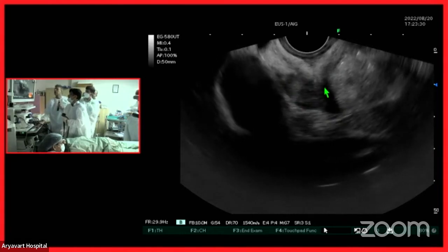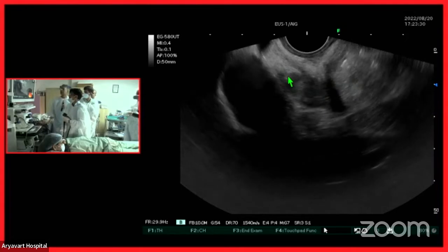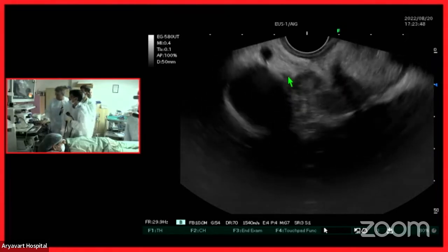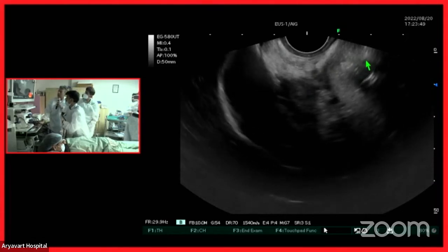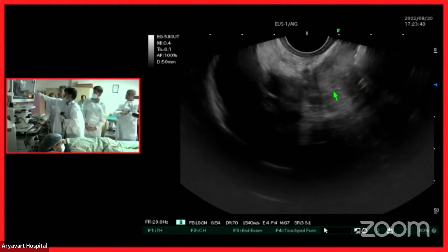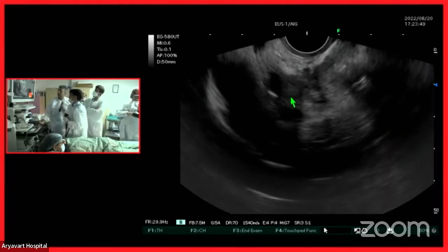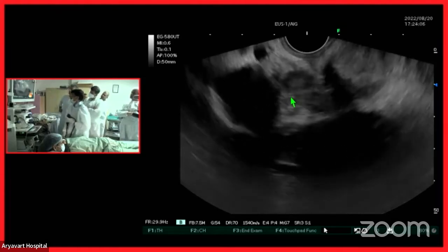This is the mass extending from the neck into the CBD, then encasing the hepatic artery and going higher up, encasing the portal vein. Beautiful. And this is where you see stones in the gallbladder in this view. Lining bile and echogenic. We're seeing some acoustic shadowing here, not as clearly as you would normally find, but I think there is that triangular acoustic shadowing going through.